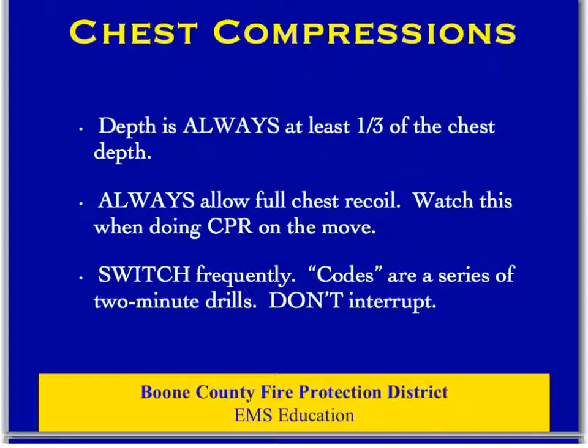This is a big deal when you're trying to do CPR on the move. It's very difficult to brace yourself appropriately in the ambulance and be safe and still do effective CPR. There's a lot of concern about CPR on the move and how ineffective it is when we're doing manual compressions. Another advantage of the mechanical CPR devices is that they don't really care whether they're moving or sitting still.